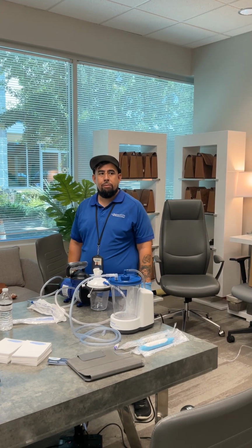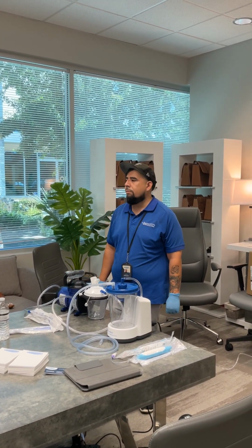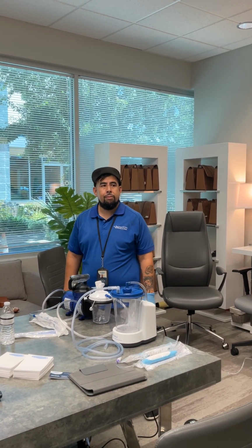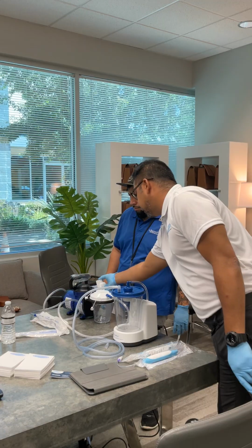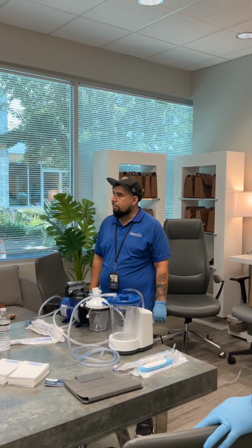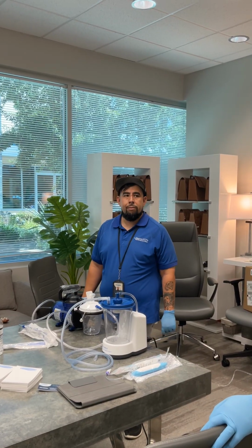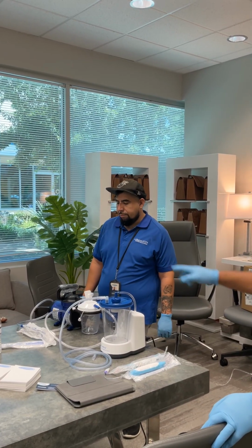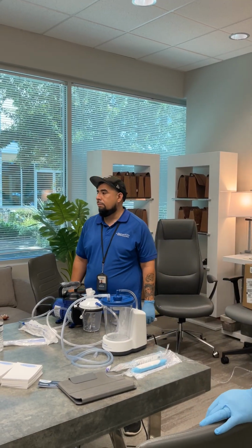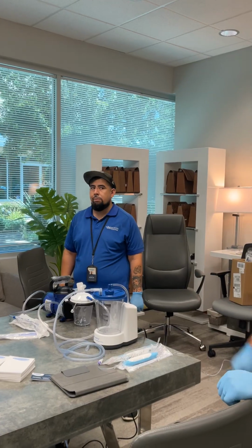Again, if it cracks or whatever, just give us a holler. We run 24/7, 7 days a week. Other than that, the bacteria filter is good for about a month. It also comes apart, though, so you can wash it with soap and water. But I think that's pretty much it. You don't want to put that all the way back into the throat or anything. It can induce vomiting, so you don't want to do that. So just the mouth region, usually into the cheek, same deal.